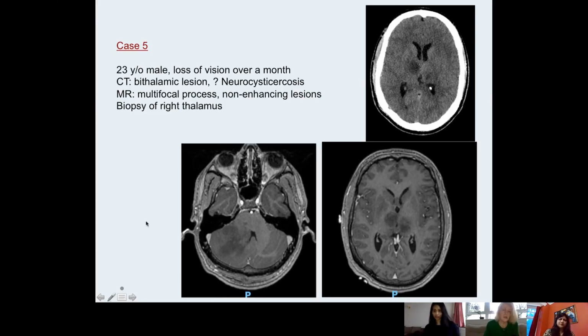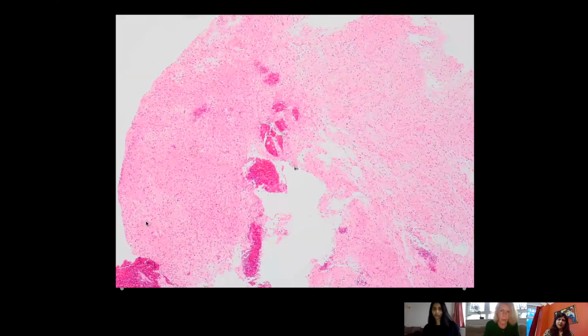And so he had a biopsy, which showed the following features. We can see here that we have a lesion that looks neoplastic already at low magnification. This is not a reactive or infective process that was suspected in the first place. The lesional cells look quite monomorphic, and the tumor is only moderately cellular. Most importantly, it is seen diffusely growing in the CNS parenchyma. So this is a diffuse type of tumor.